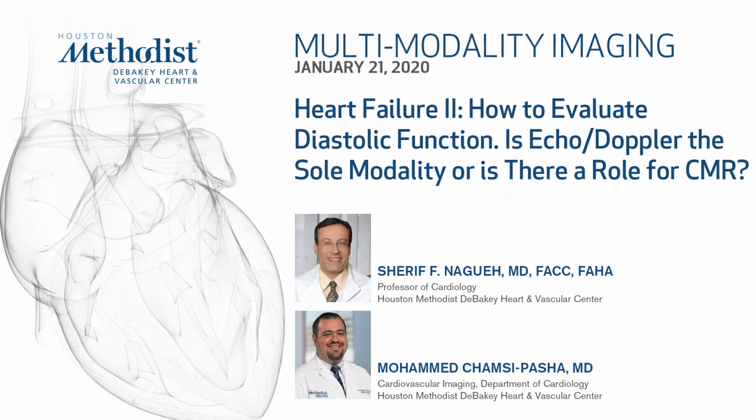We're going to start. Today is diastolic function assessment. What are the techniques that are used to assess diastolic function? It's really echo and echo. You will hear from other speakers who are my dear friends.